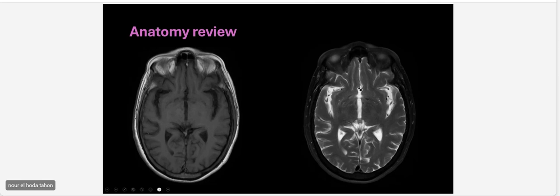Okay, so it's not small vessel disease, it's perivascular spaces. I know it can be an infarct, right? Even for us, sometimes we don't know, maybe a lacunar infarct, because the basal ganglia has this area, and it can be cystic. I don't know, I have to look at it. It could be Virchow-Robin spaces, like perivascular spaces.